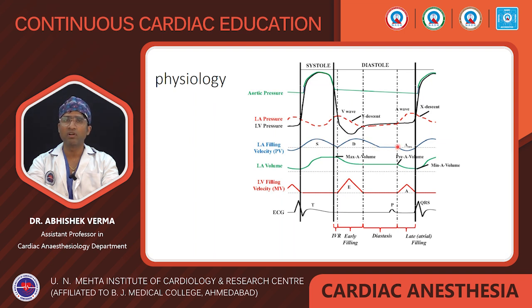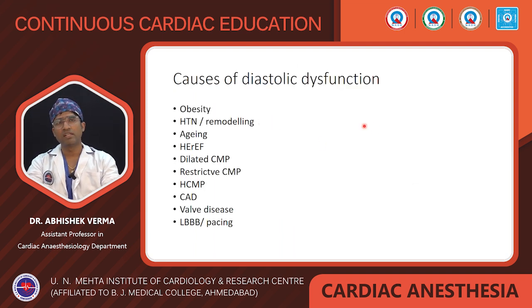And after atrial contraction, the atrial reversal will occur during the atrial A wave, atrial systole. So this is the atrial reversal wave, and this is the A wave. We can also focus on this when we are discussing diastolic dysfunction. We will see what the causes of diastolic dysfunction are, which are shown by the study.